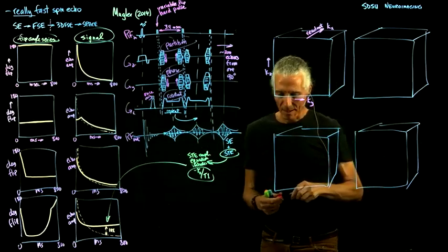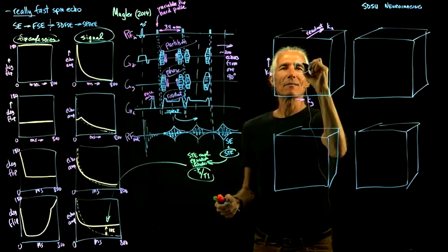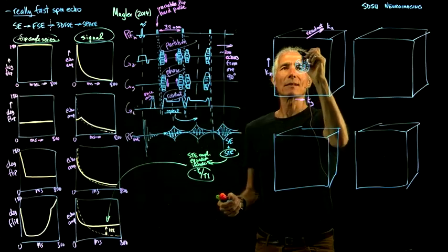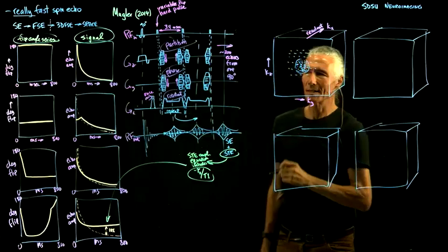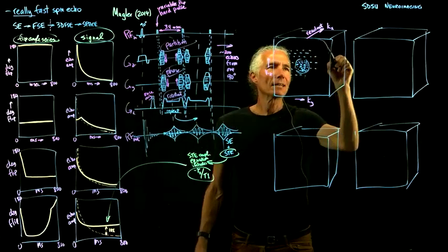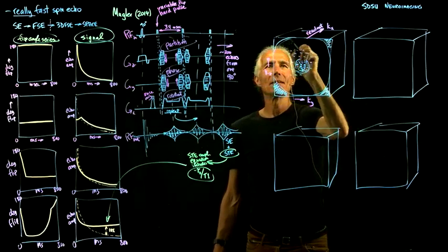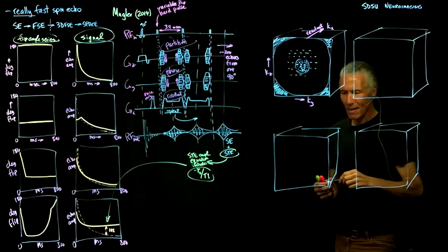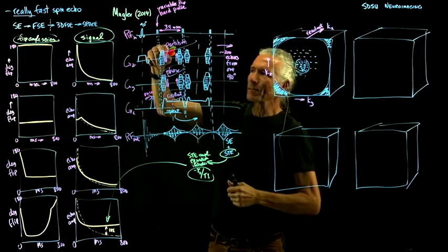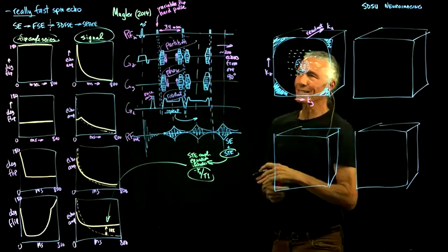So that's the same down here. So what's the first way to save points? Basically, just record a lot of data in the center of K-space, and then when you get out to the outside of K-space, record less data, because we know that the center of K-space is particularly important for controlling the contrast. So just start leaving out some data points. Don't bother recording all the way out to the edge. So just record like a cylinder of data. Throw this away, that's extra high frequency. That saves a little time. And then do a tricky method. Like the way I've drawn it here, for this setting of the Z gradient, do all of these ones of the Y gradient, but that takes a little more time.